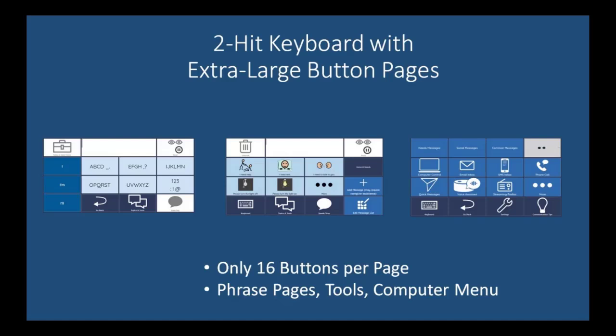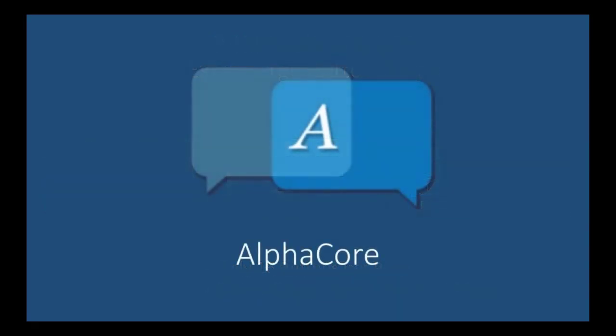Contact your speech therapist or the device vendor if challenges persist. I hope this video was helpful and enhanced your confidence in positioning the device for someone using eye tracking.